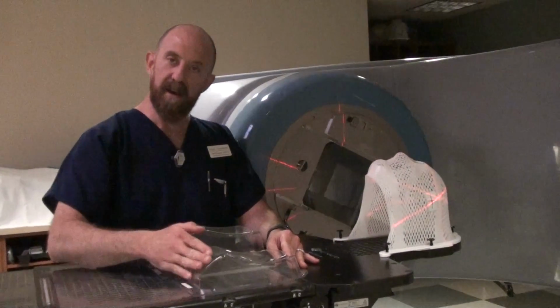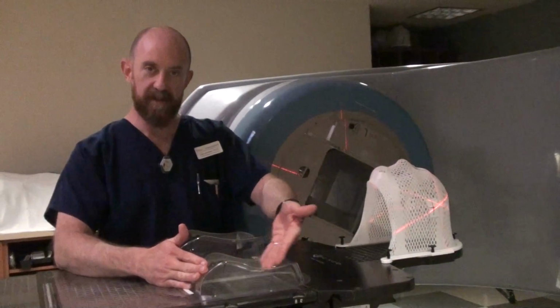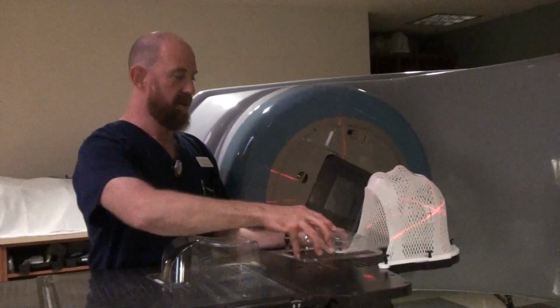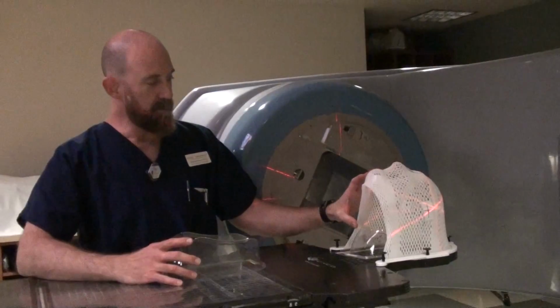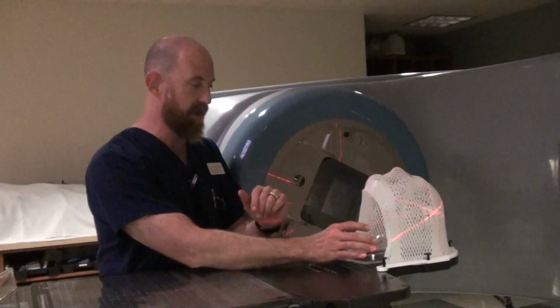Once again, the neck will fit into the curve. The skull base will fit into this part, kind of the cup or the bowl. And then the patient will go on top of like this. They will end up kind of in a clamshell position and thus being held in position properly.